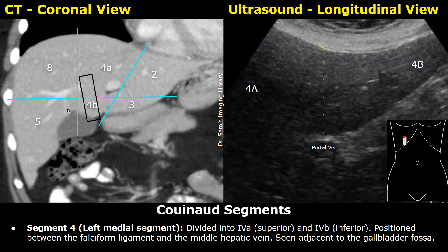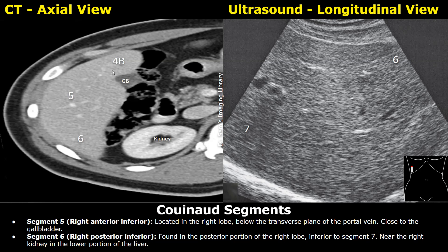In this image, the probe is placed in a longitudinal plane between the ribs, basically at the center of the liver. Here we will see segments 4a and 4b. Segment 4a is seen superiorly towards the patient's head or towards the diaphragm, and segment 4b is seen inferiorly. As we go down in the CT image, we will see a small part of segment 4b near or just anterior to the gallbladder.